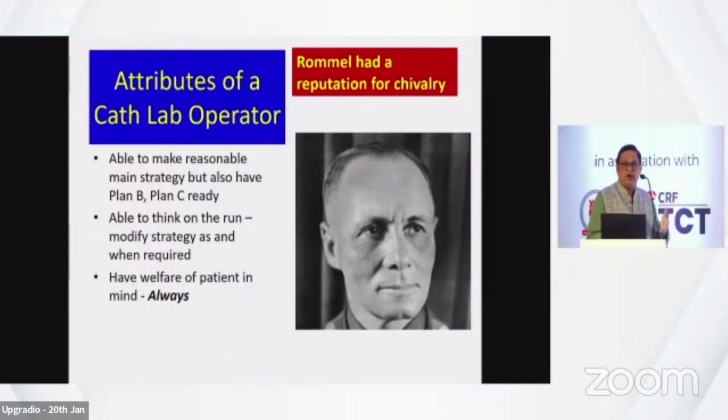So as I said in the last cases, as Dr. Anil also said, this is a person who's likely to have perforation. If it happens, then this is what I'm going to do. So make sure those things are available. You have a covered stent available with you or not, in a case where you think perforation can happen, or in a case where embolization can happen. Do you have the snares available with you in case you have to retrieve it? Or you have those proper dilatation balloon catheters, non-compliant high pressure balloon catheters or not, if you want to crush the stent to the size. So those things, I think you should make sure. And if that happens, go to plan B, go to plan C.